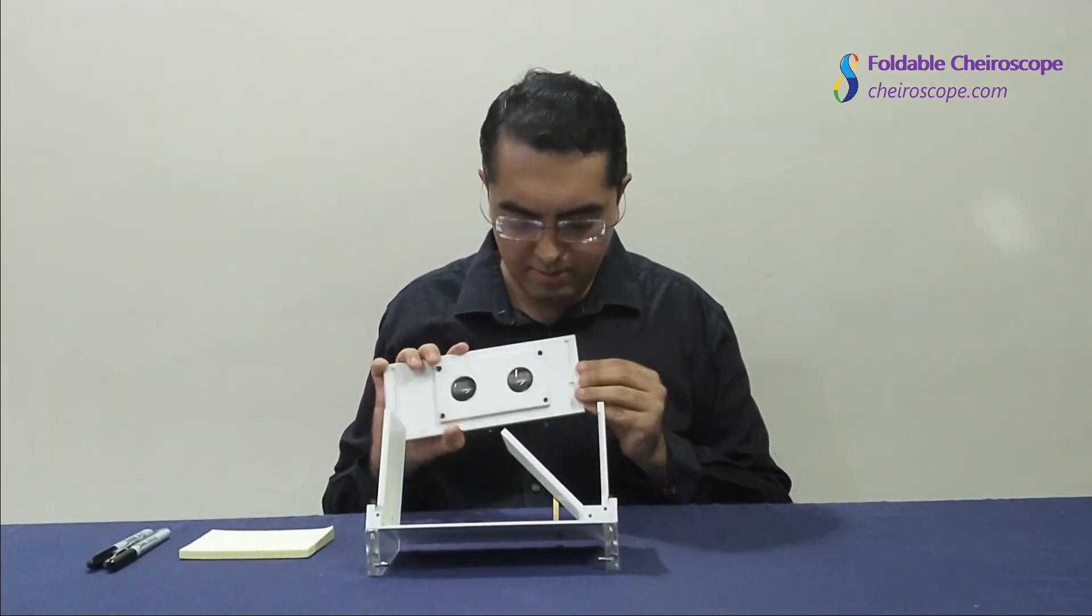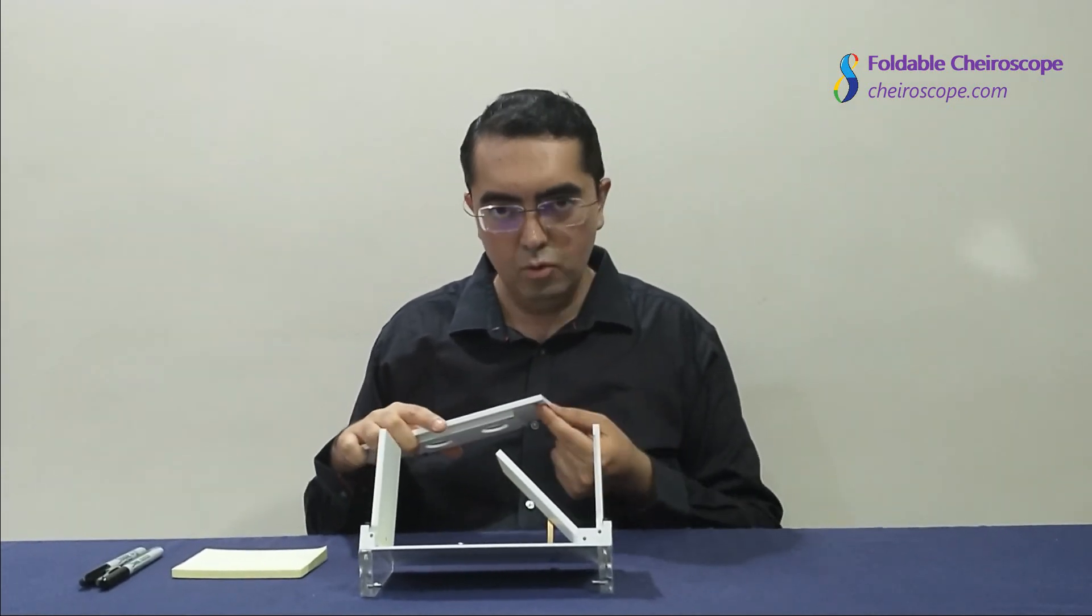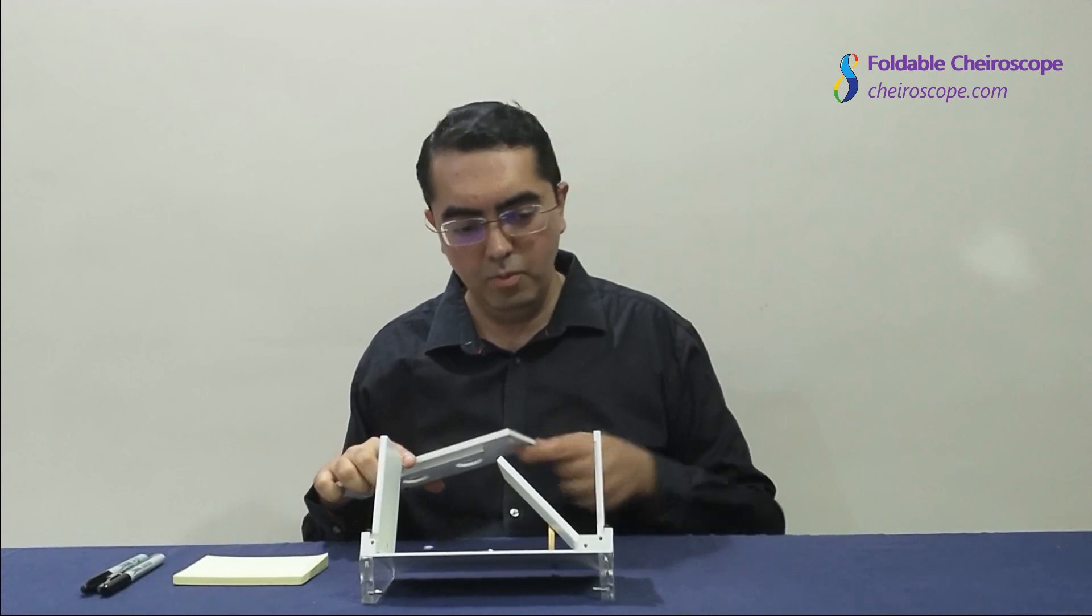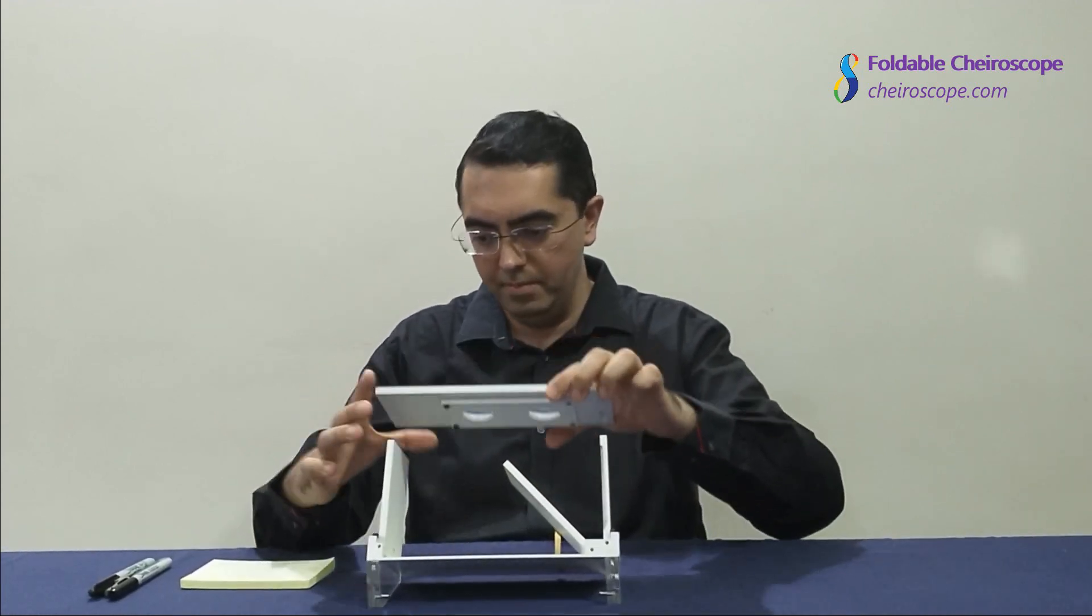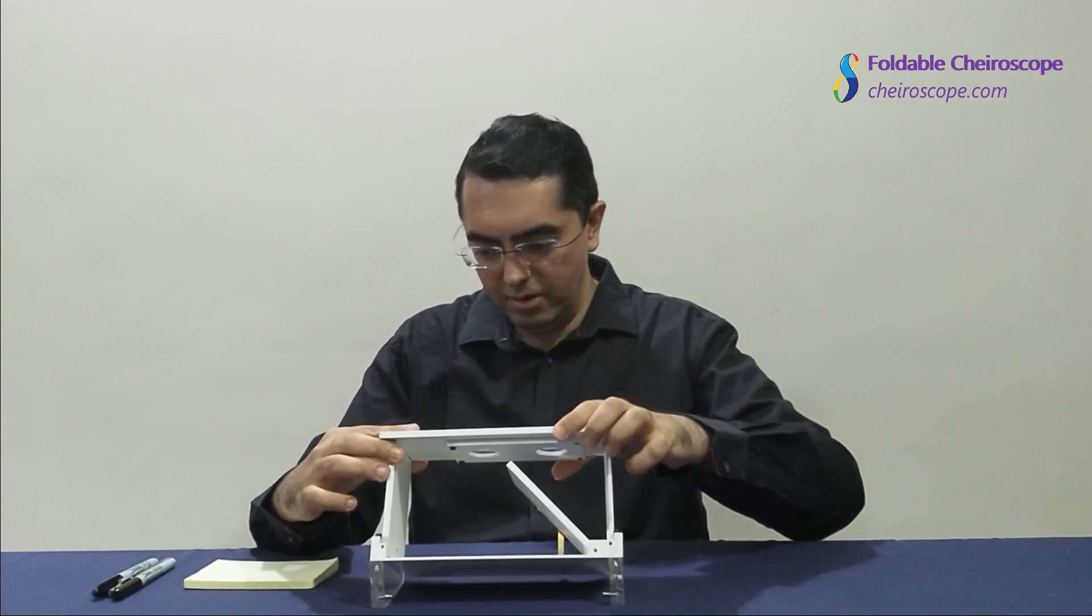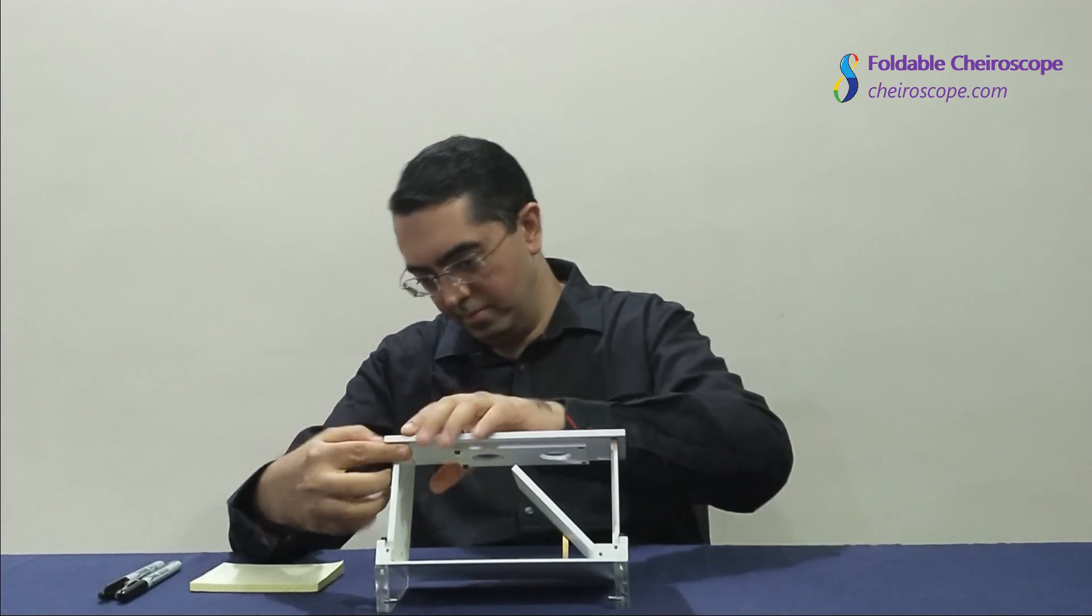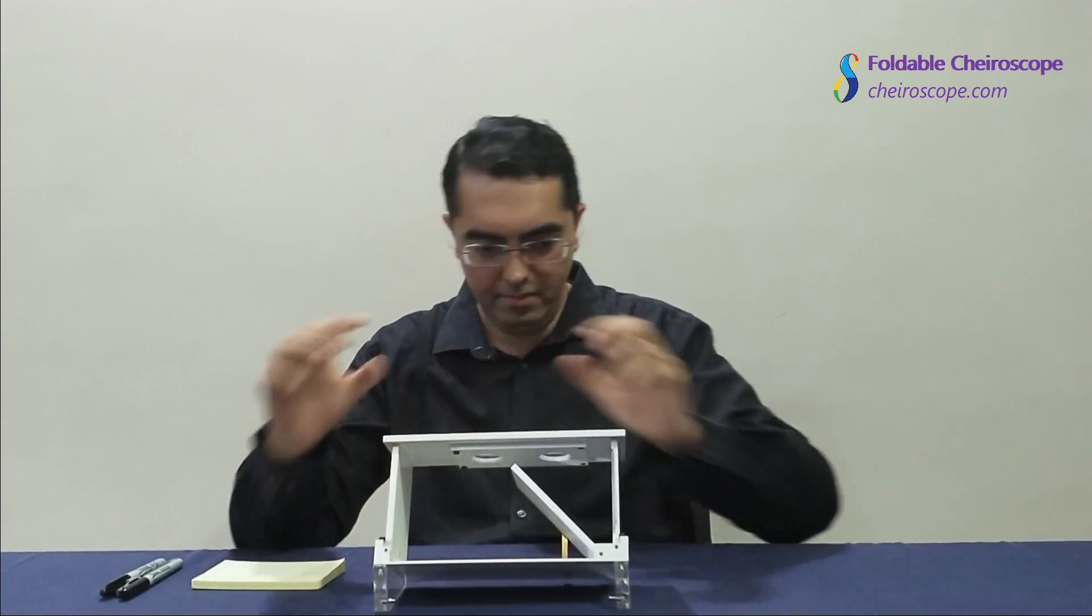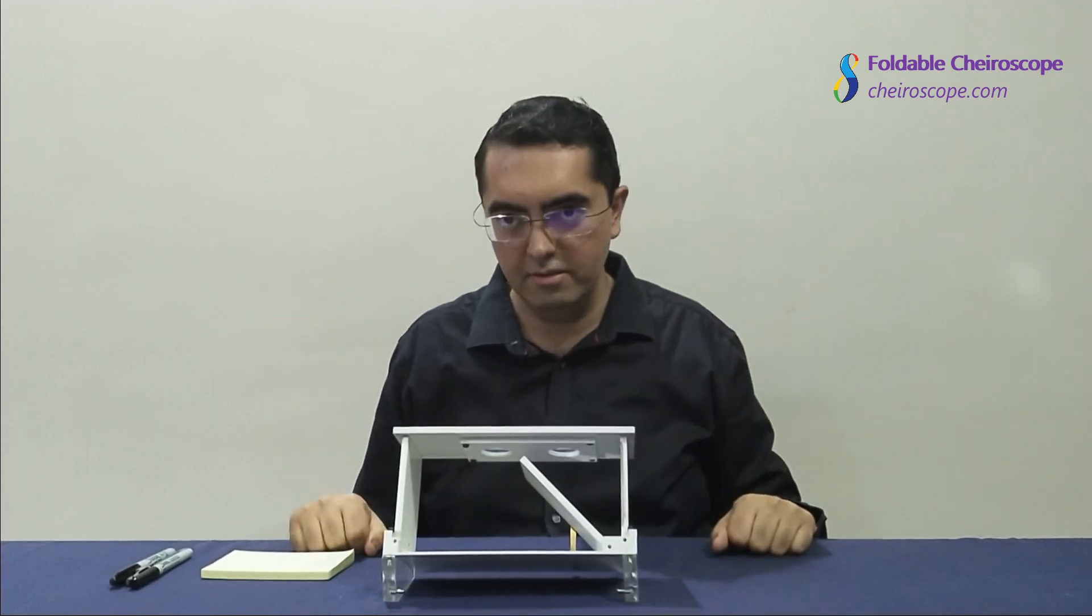This lens plate has been designed such that it can only fit in one direction. There are two slots underneath and they correspond to the respective slots on the vertical plates. Just place the lens plate on the vertical supports and it sits nice and snug.